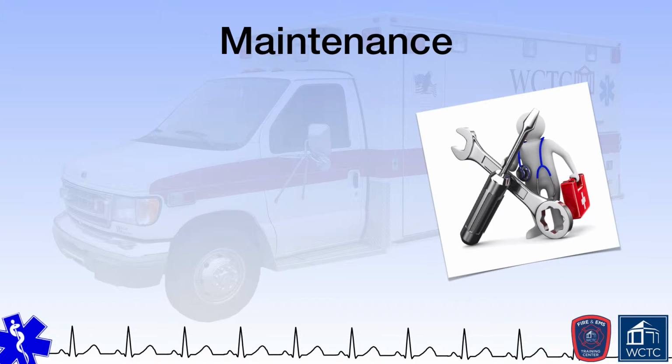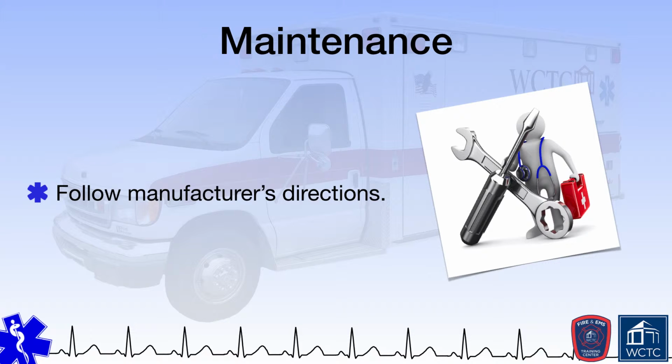Maintenance of your patient movement equipment is very important. It is also very specific to the piece of equipment. For example, a powered stretcher will have more maintenance than a plastic longboard. Regardless of the piece of equipment being discussed, you should always follow the manufacturer's directions for cleaning and maintenance.